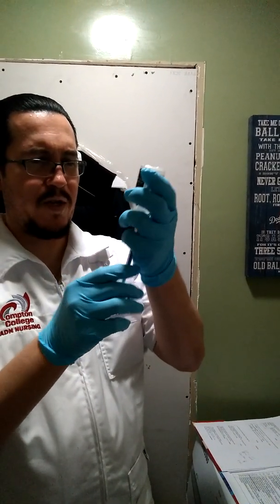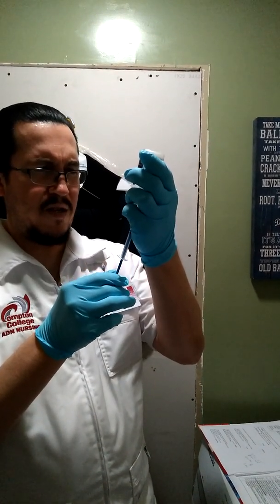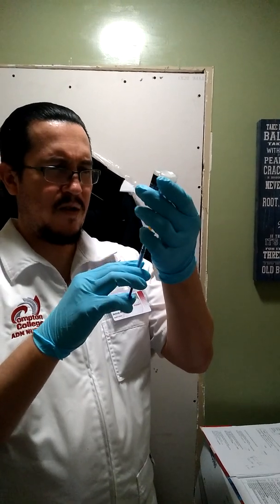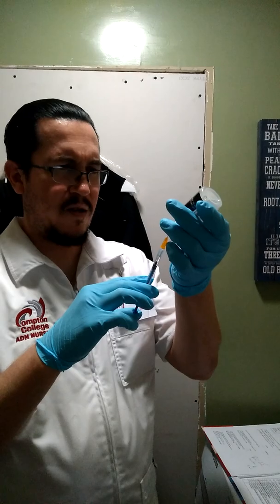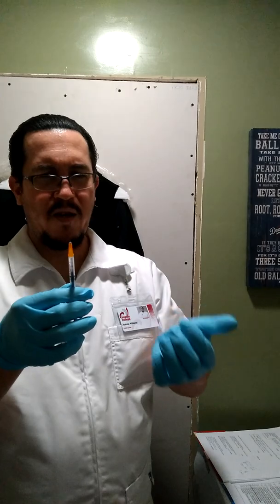Make sure there's a window so I can see. Okay. Make sure we remove the bubbles. Okay, everything's good.